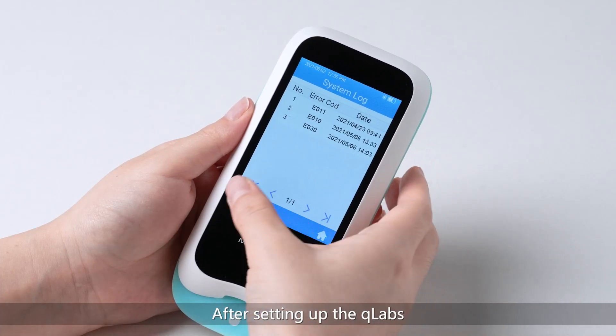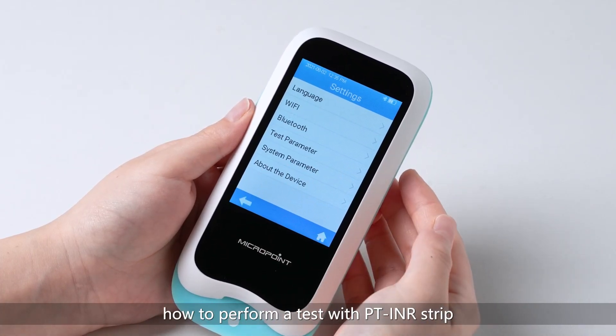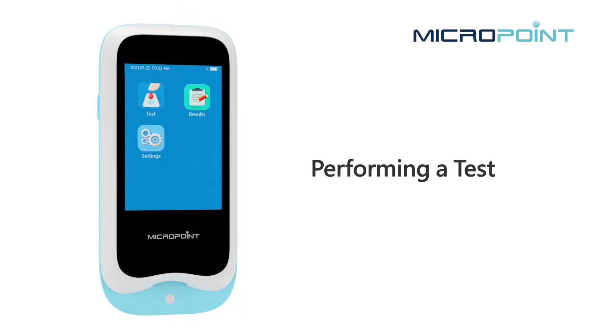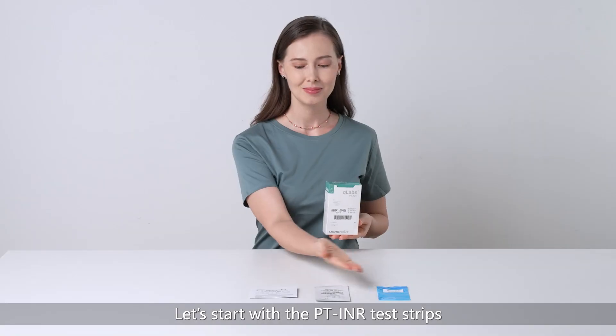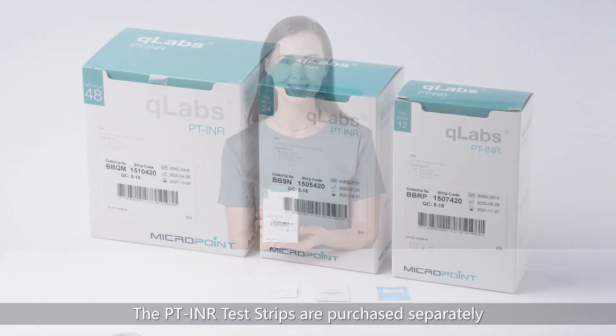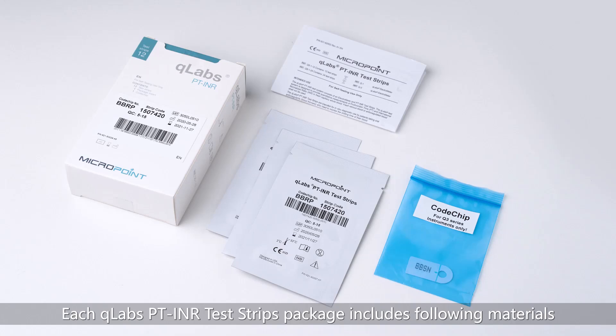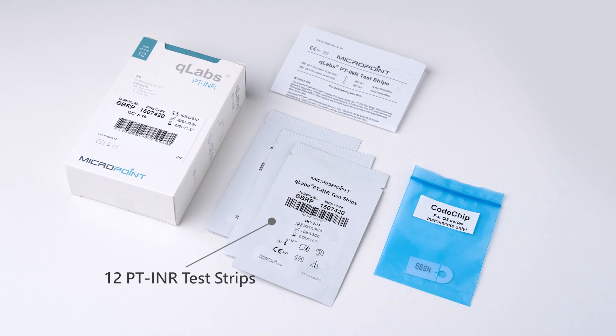After setting up the Q-Labs, this demonstration will describe how to perform a test with the PT INR strip. The PT INR test strips are purchased separately and are available in 12, 24, and 48 strip options. Consult the user manual and test strip insert before you perform any test. Each Q-Labs PT INR test strips package includes 12 PT INR test strips, 1 code chip, and 1 insert.